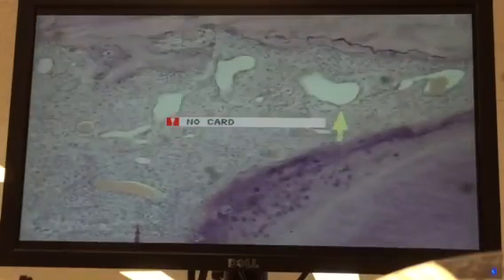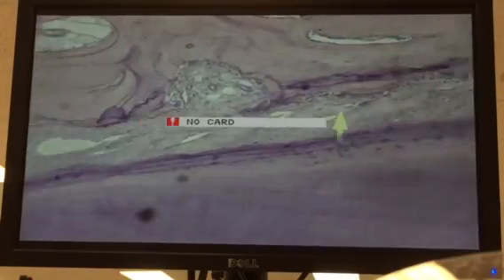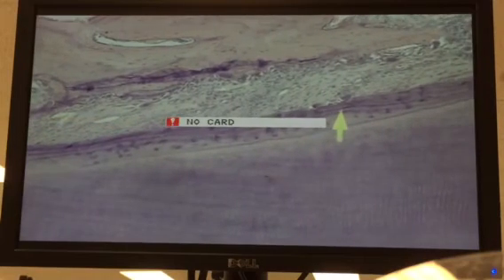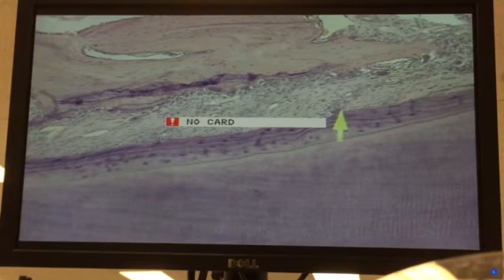Anyway, on those slides, you might see some remodeling going on, and also some bone or cementum formation as well. And also that's probably, well, there's a cementoclast right there, and some more osteoclasts in that same field. So make sure you take a look at those slides. Those will be the ones that I'll look for to show certainly the odontoclasts and cementoclasts for that next lab practical.